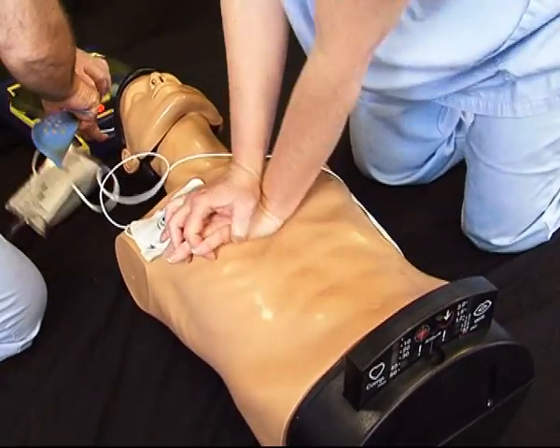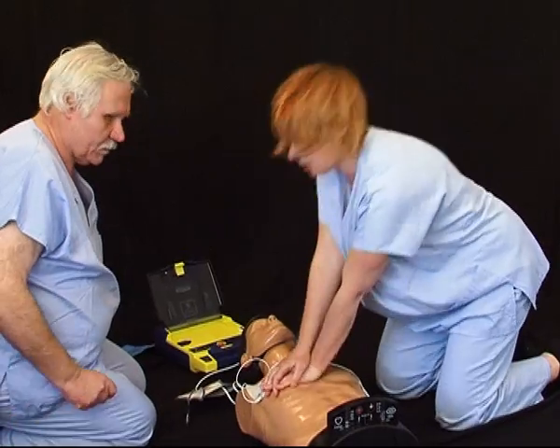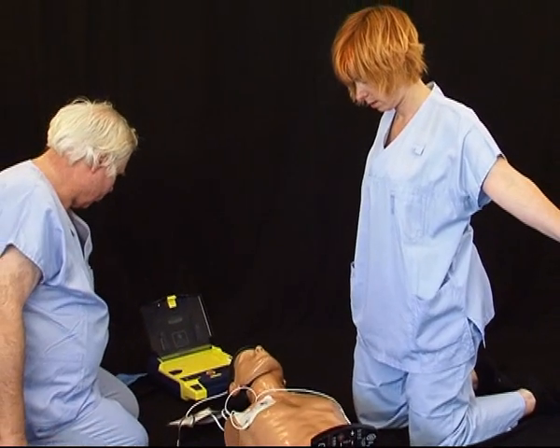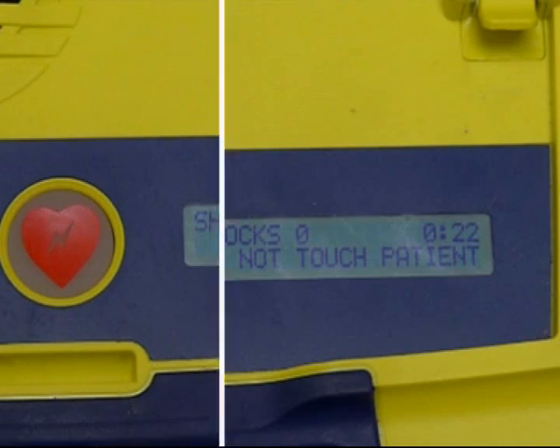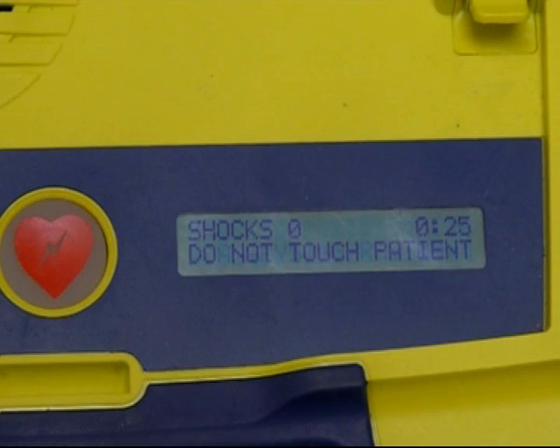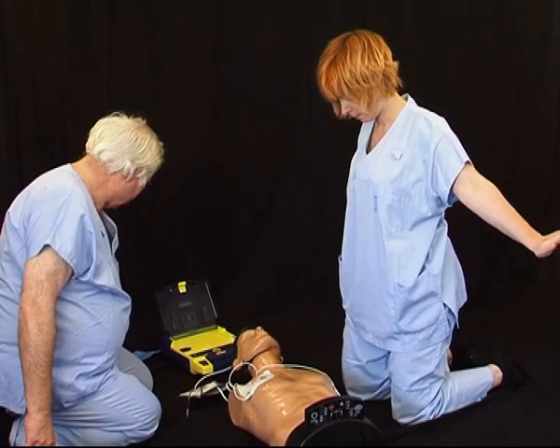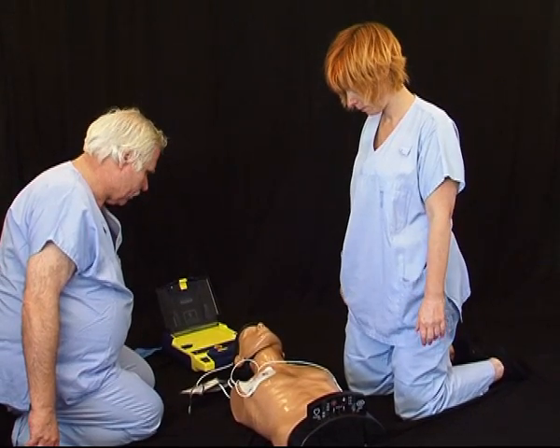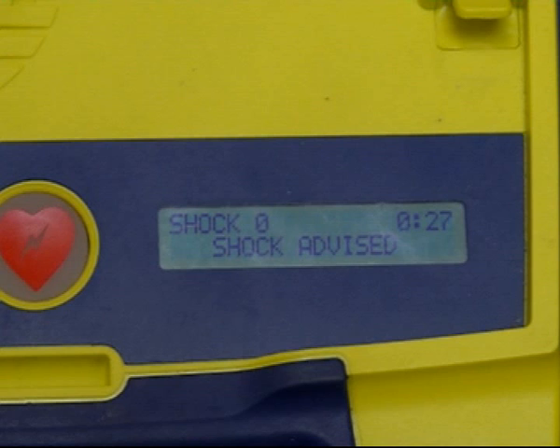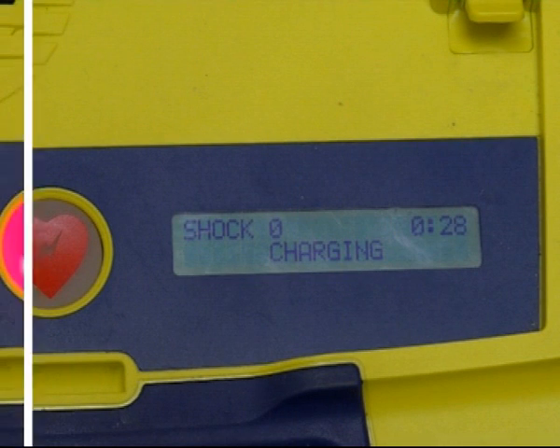Do not touch patient. Analyzing rhythm. Shock advised. Charging. Stand clear. Push flashing button to deliver shock. Shock delivered.